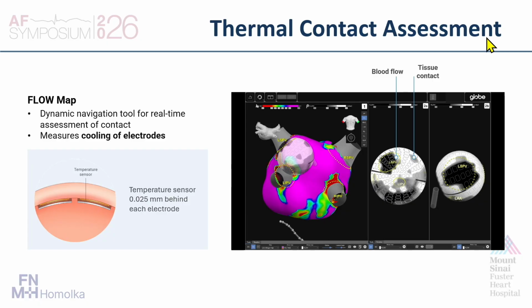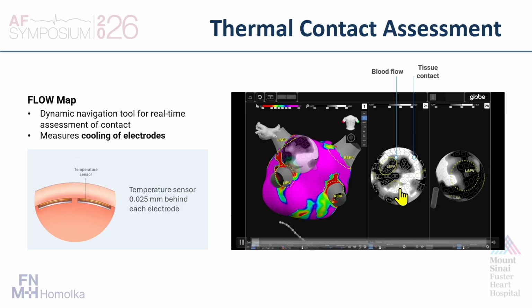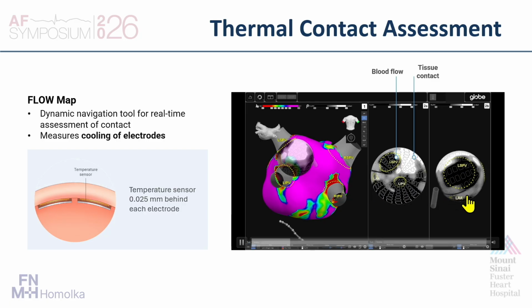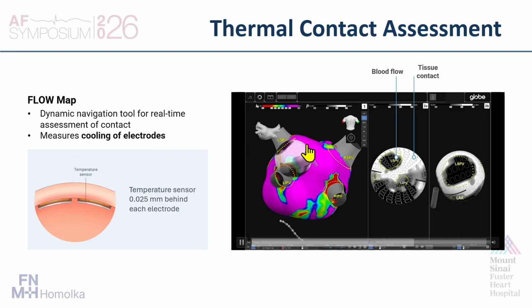Now, when we talk about contact, it has two contact sensing strategies. One they call the flow map, and the other one is called the contact scan, and we'll get to that. But this is the flow map, and this is what we use when you're actively manipulating the catheter within the chamber, and you can actually see it on here. The white represents contact with tissue. The dark black represents just blood pool. And the way it does this, it measures cooling of the electrodes. It's dynamically looking at the electrodes as they're cooling. Because if it's blood, it gets cooled very quickly. If it's tissue, then the temperature starts to go up.